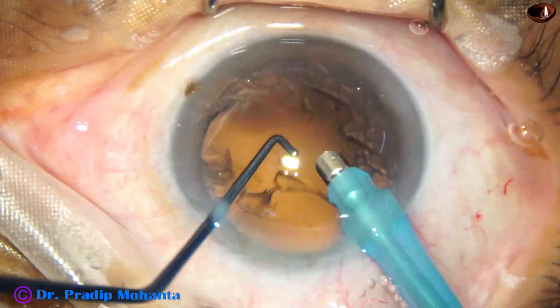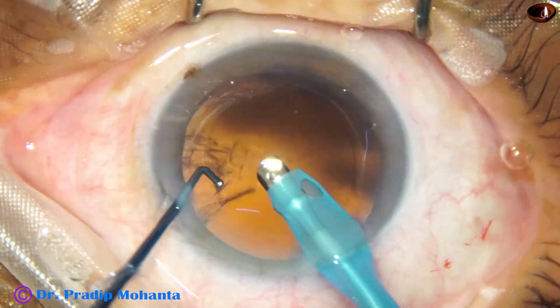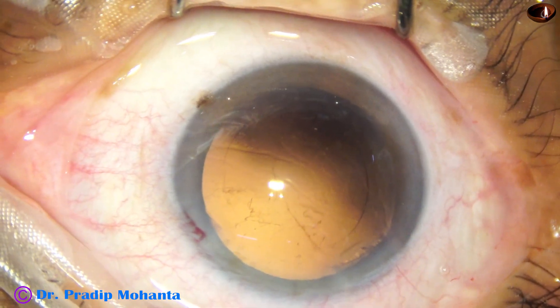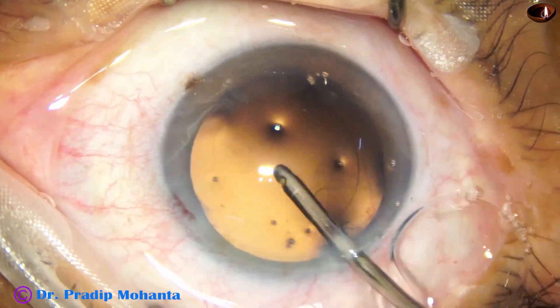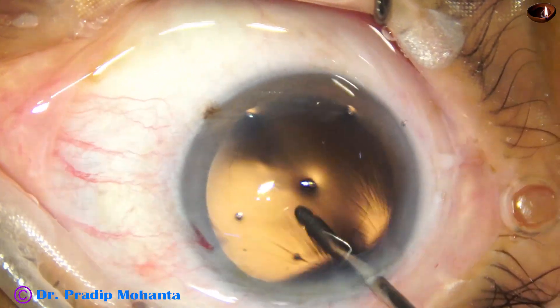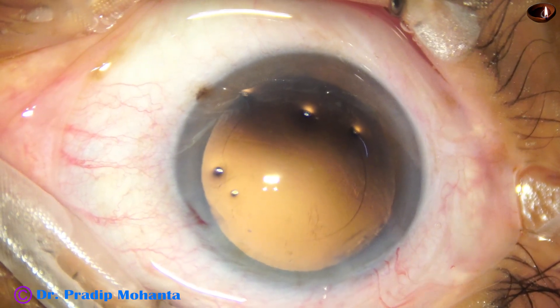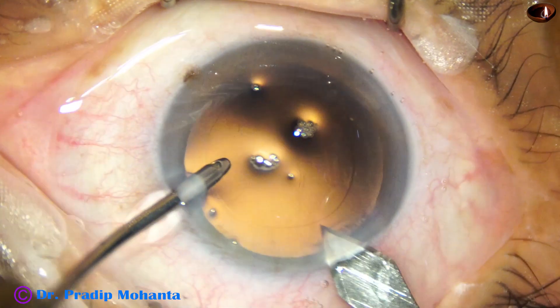Now watch cleaning of the cortex by the handpiece itself. The ball-tip chopper protects the posterior capsule and very quickly we can remove the cortex. There are some lens fibers sticking to the posterior capsule and that is being removed by the irrigation cannula itself. The irrigating jet of fluid is directed and the cannula is moved side to side, and by this movement the cells that were stuck to the posterior capsule come off.